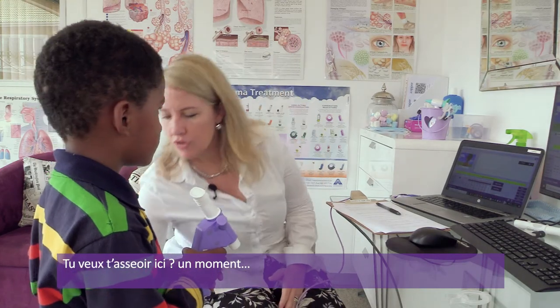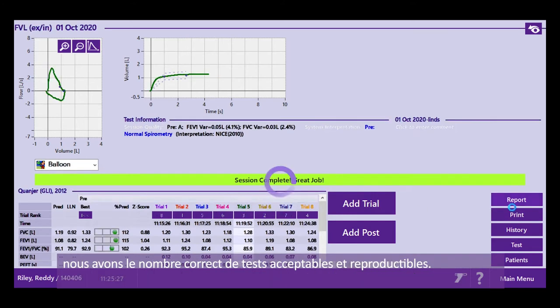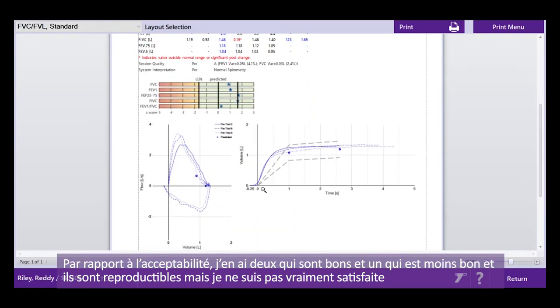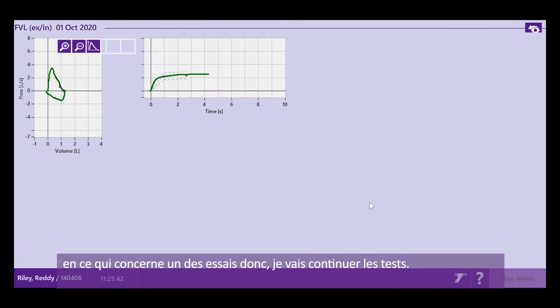Okay, do you want to take a seat on your little chair here? There you go. Sit down for a moment. Right. I'm just having a look at what we've got. So what I'm doing now is I'm looking through each test individually to see which ones we can keep and which ones we need to discard to make sure that we've got absolutely perfect, acceptable, and repeatable tests. So in terms of acceptability, I've got two that are good, one that is less good, and they are repeatable, but I'm not so happy with the one blow, so I'm going to keep testing.